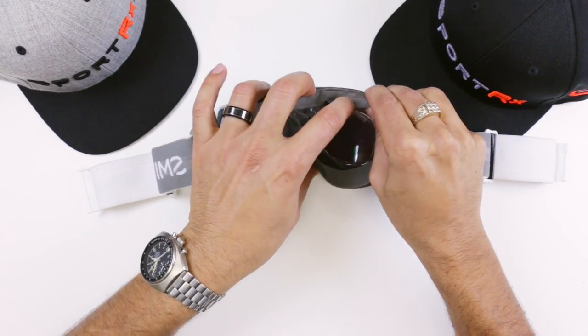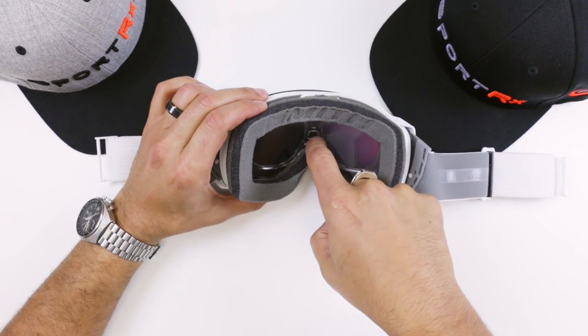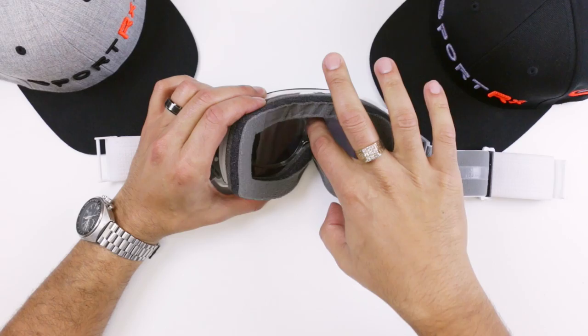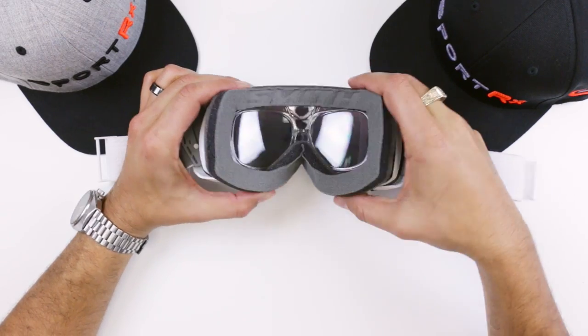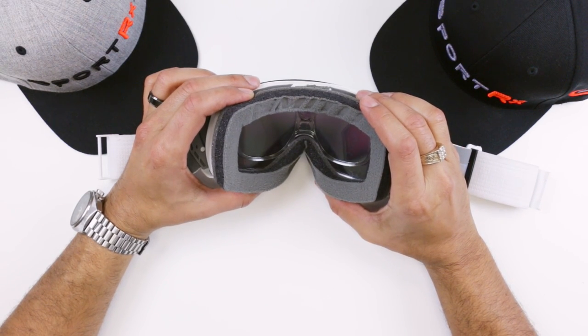Roll open this foam a little bit and the insert will go in there. Make sure that you're over the ridge on the inside of the foam and make sure that the insert is nice and balanced from left to right — not crooked or anything. This looks pretty good right there.